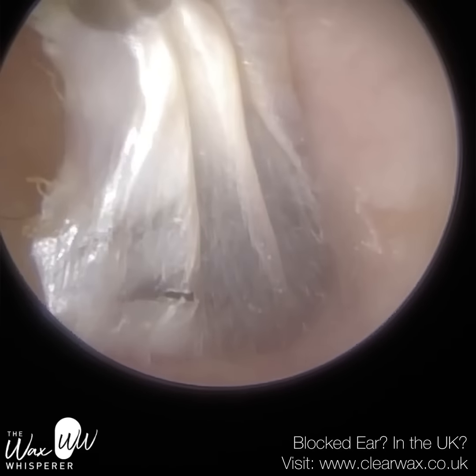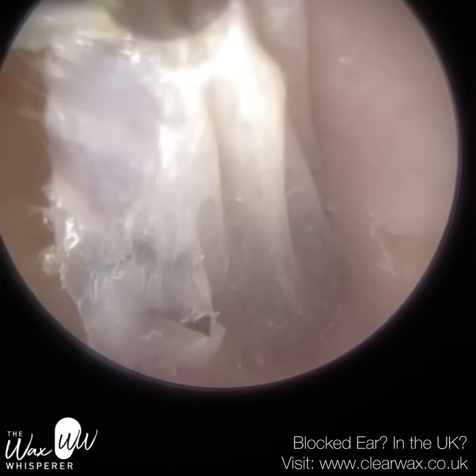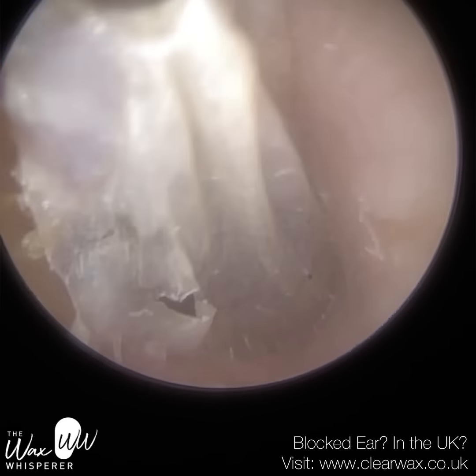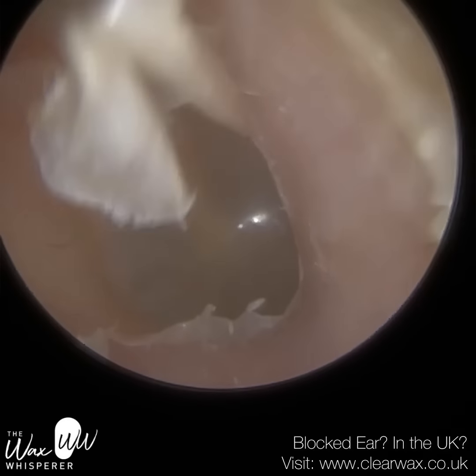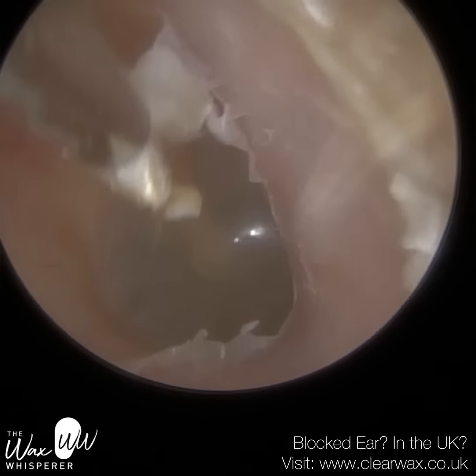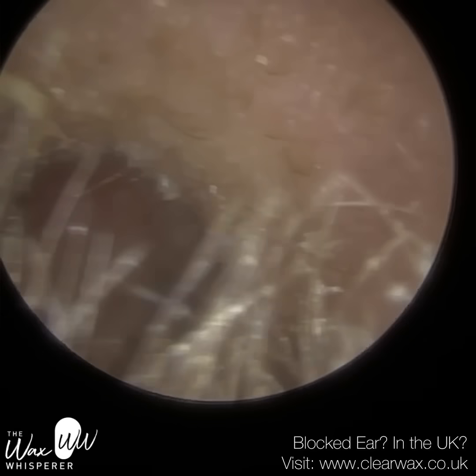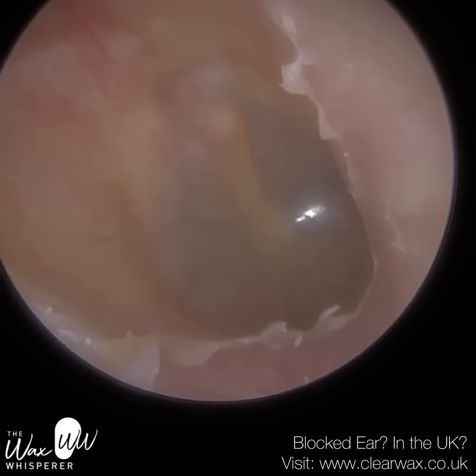So really tugging away at the skin, you can see it going up and down, up and down. We're not going to get every last shred, and when we go to the eardrum, we're going to be really careful because you will get separation of the skin. It tears away near the eardrum, so we're trying to get the majority out here. This skin is going to come back for the patient. It's a chronic condition because the skin's just failing to migrate.